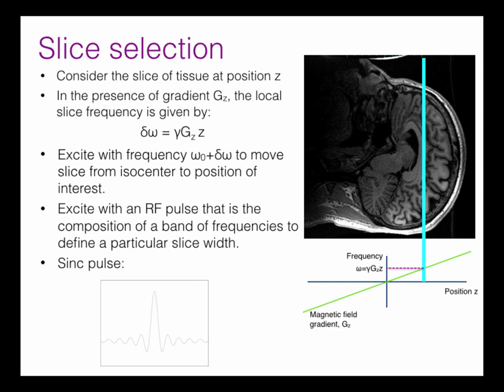So what I can do is design a pulse. I have one of those B1 pulses I was using before, but it only contains a mixture of the frequencies present in this band.